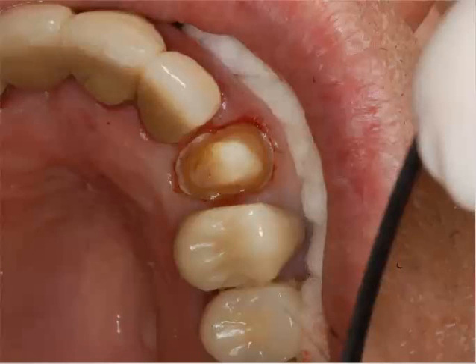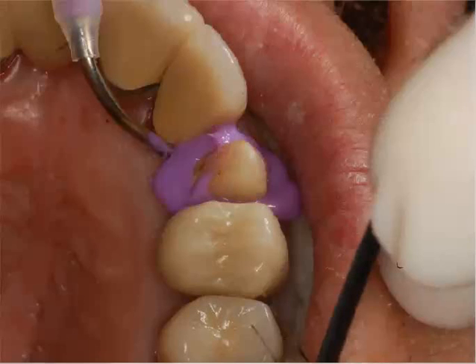And this is left in for 2 minutes. Once it's left in there, you go ahead and rinse and dry it. It does a really good job when you have those types of conditions present. When you get deeper preparations, that's where you have to consider placement of the cords. But the aluminum chloride itself as a chemical does a good job in those kinds of cases and really allows you the freedom of not having to place the cord.